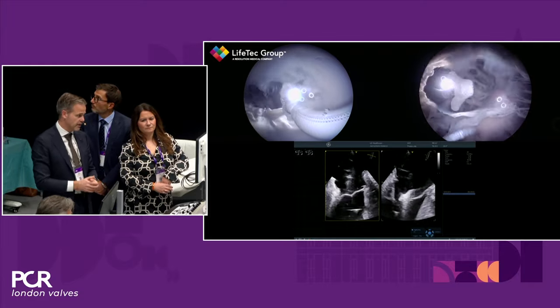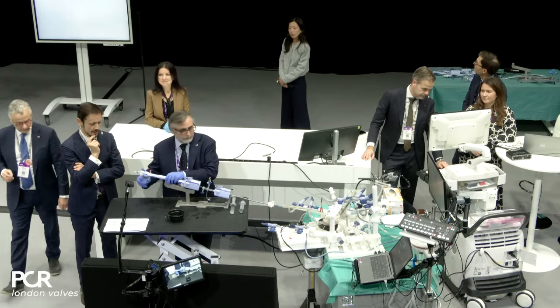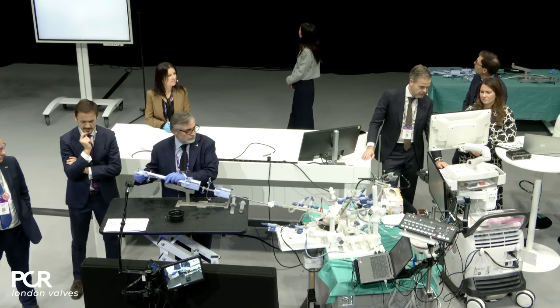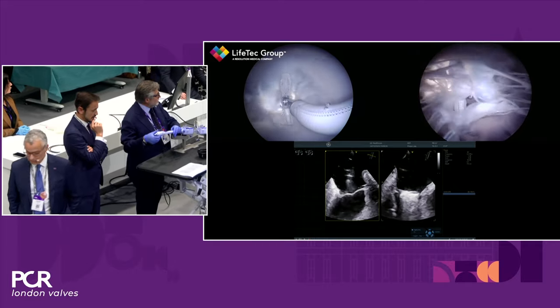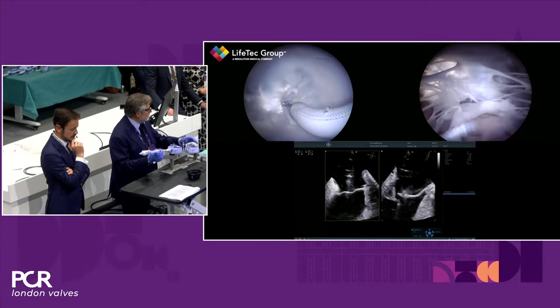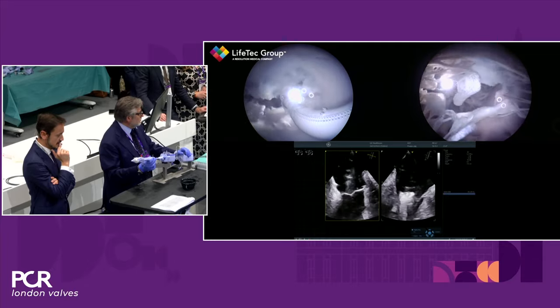And then the perpendicularity. So then we now open the clip arms, correct? Yes, you open the clip arms and you check the perpendicularity of the clip arms to the line of coaptation. So in this case, being in A2P2, usually you just point to 6 and 12 o'clock. And then after checking your gripper, obviously, you can advance the clip. Paolo, closing the clip is a good practice.